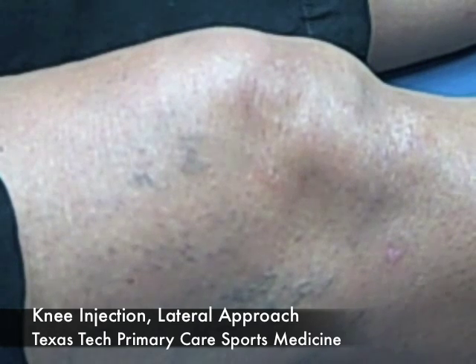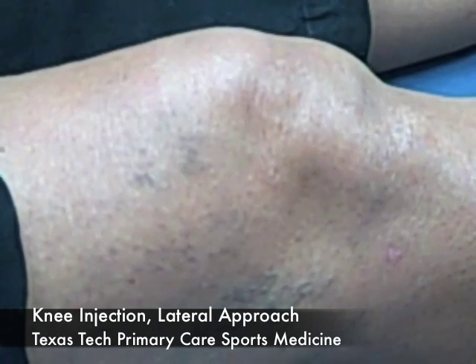Today we're going to demonstrate the technique for an intraarticular knee injection using a visco supplement. The main indication for the injection today is osteoarthritis and the main goal is pain relief. Risk and benefits of the procedure have been reviewed with the patient and the appropriate consents have been signed.